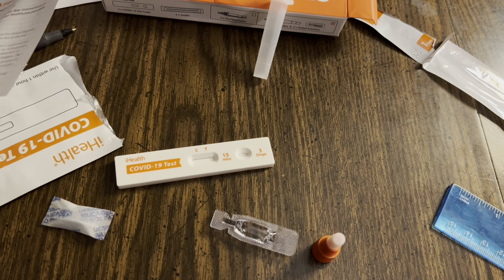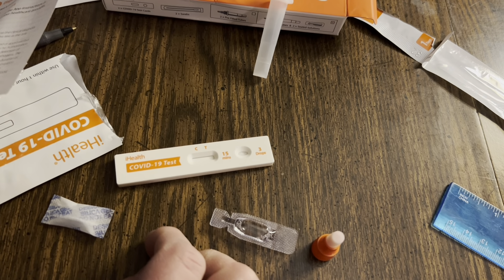More like down here though. You don't want to see me stick this up my nose, so I'm just going to do it. It says to slowly brush like five times in a circle. On another test I did, it said you want to be up there for about 15 seconds. Do both nostrils. It should feel uncomfortable — like somebody's tickling the inside of your nose, because you are.